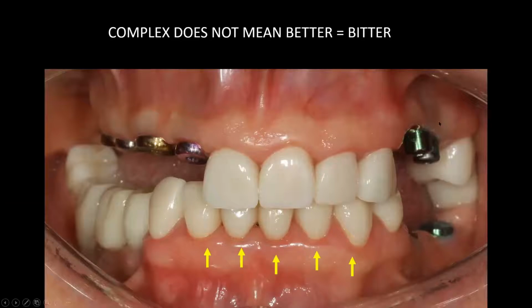Well, this work was done in the Soviet country, and basically they had infections and had therapies and teeth were removed. But the problem here is that no attention was paid to the periodontal tissues. And these zirconia crowns are extremely poor fitting. And you know, Stan, there's too much emphasis on placing zirconia crowns when the actual fit of the zirconia crown, the subgingival margin, and the cement retention is just notorious for periodontal health.